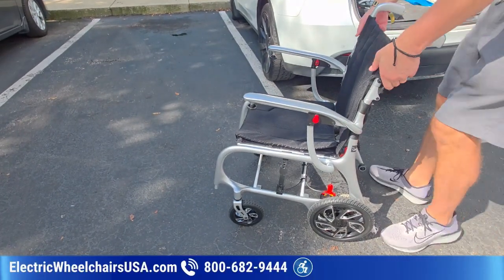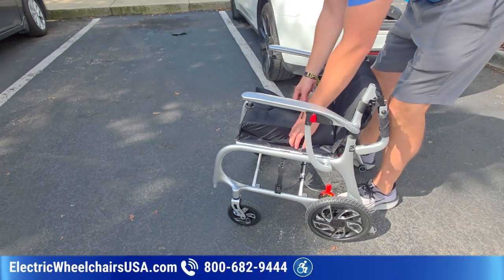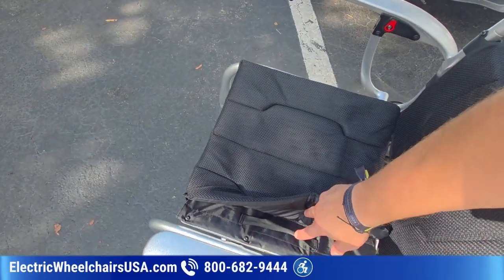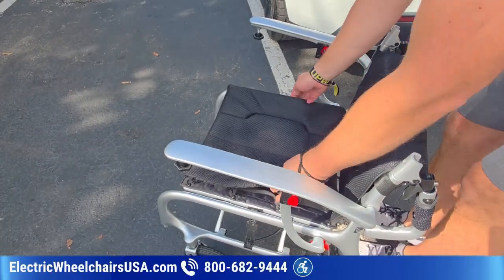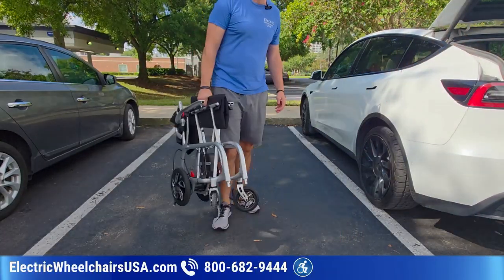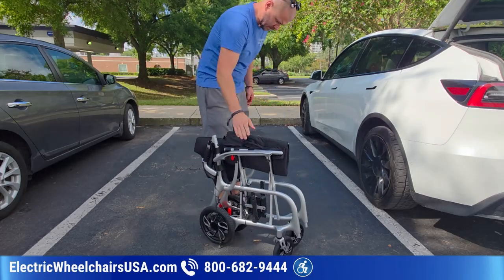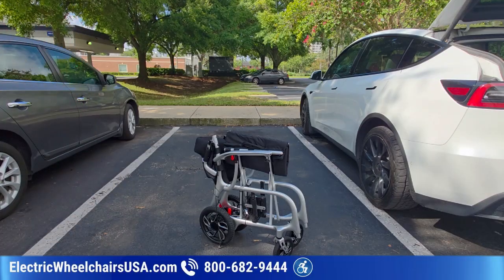So if I fold this back down, the seat back down, and then you'll actually see this is a cushion here. If I pull the cushion to the side, you can see there's a handle, and there's one on each side. So you just pull it up like that. And now this is 26 pounds. Very light. So let me put these batteries back on.